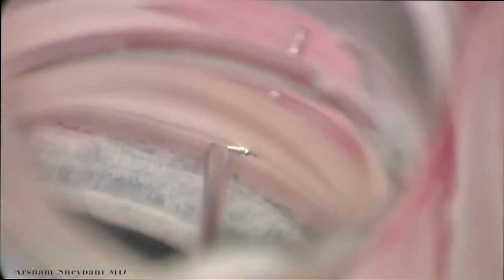We approach the trabecular meshwork with a 30–35 degree angle. And once we feel like we've placed the stent in the Schlemm's canal, we then release on the injector. As you can see here, once we release it, the stent looks a little superficial.